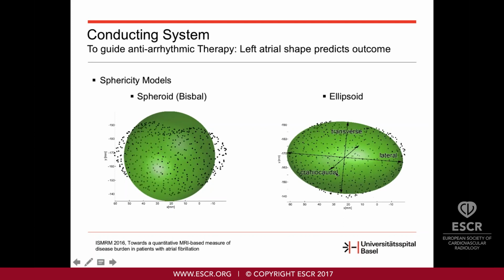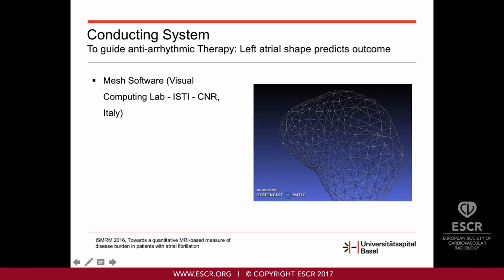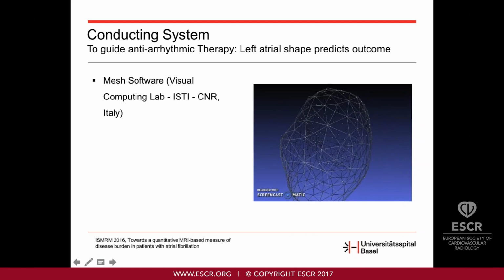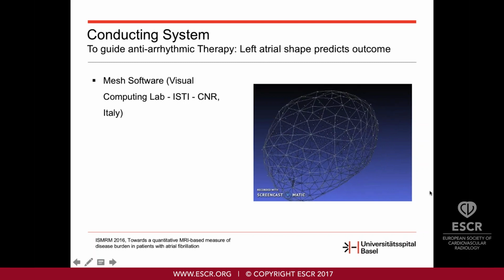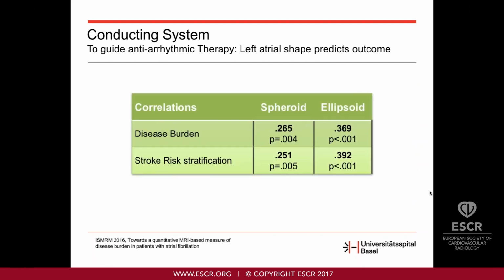MR can also be used to guide therapy or to predict rhythm disturbances that can result in arrhythmia. So based on these late enhancement images in this study, these authors found out that late enhancement imaging can help to predict abnormalities in the conductivity of the myocardium.